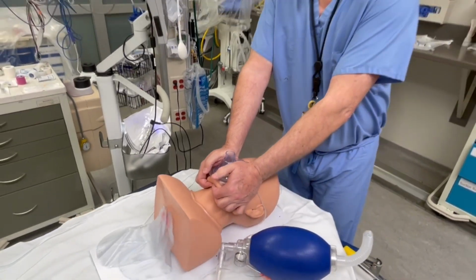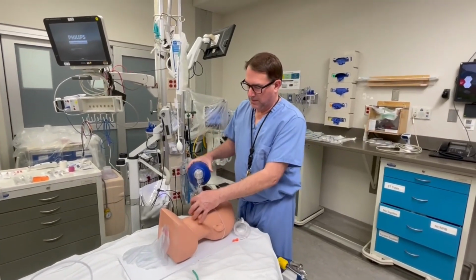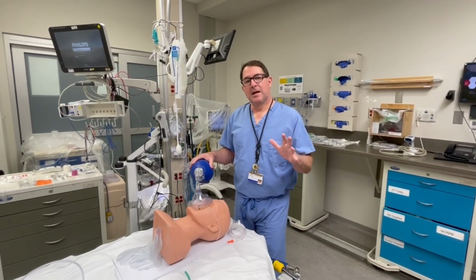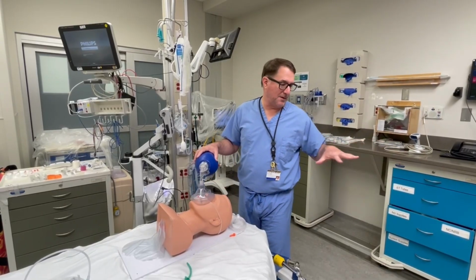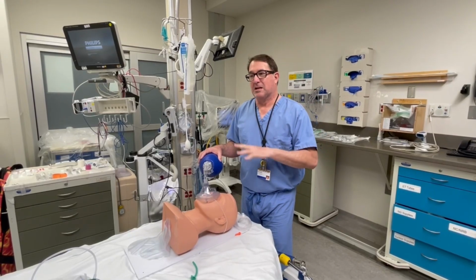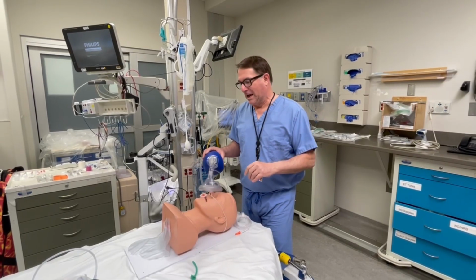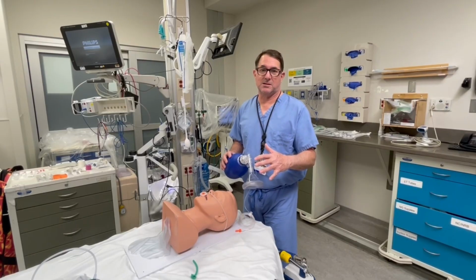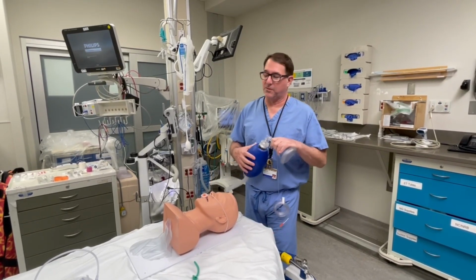I don't care how this gets done, but this right here, there's times we'll get away with it, and there's a lot of times that I'll see this being done, and we'll have a couple of physicians over here, everybody's watching the saturations, and they're not improving, and people are looking puzzled. And hey, maybe if you put in an adjunct and do two-person mask seal or two-person bagging, thumbs down mask seal, you'll be more successful.